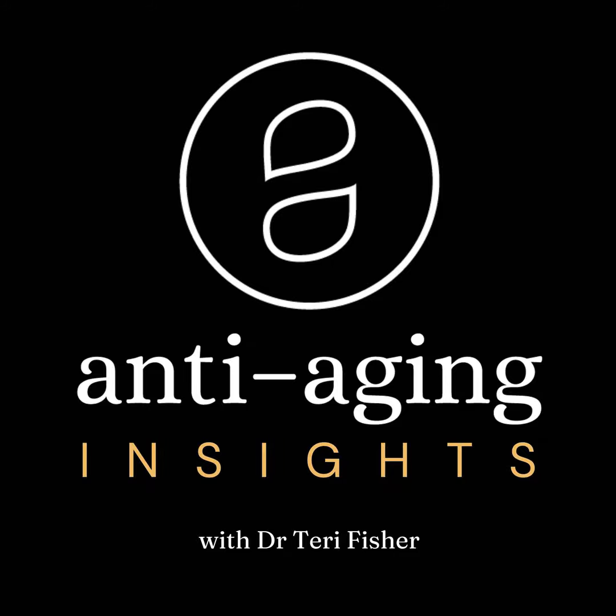What's really nice about the needle is that we are injecting the point of that needle directly down to where we want that medication or that neuromodulator to go. It is really valuable then for treating things like fine lines, wrinkles, and small areas where we want to be as precise as we possibly can. It's easier to control the depth and placement because we know where we are placing the tip of that needle.